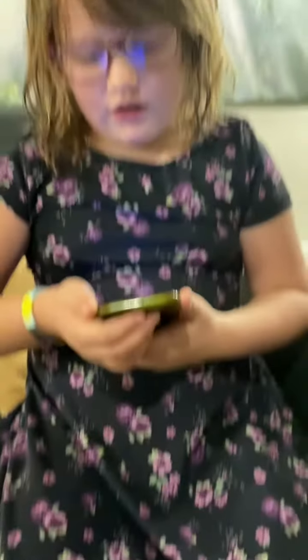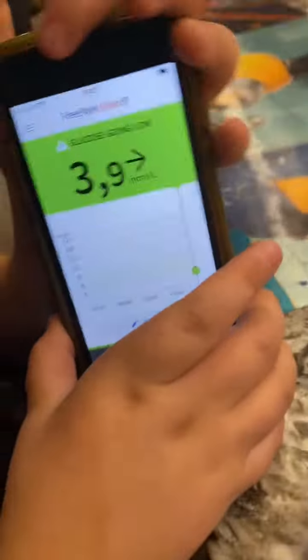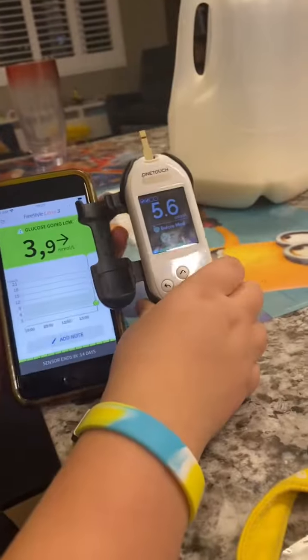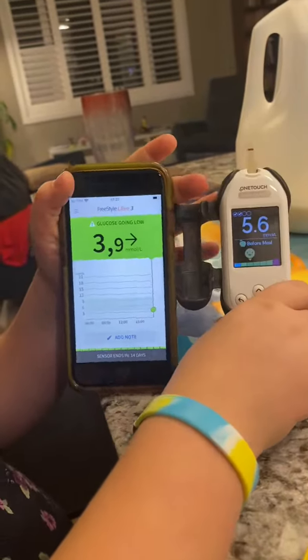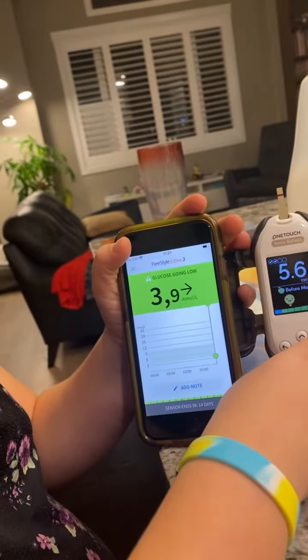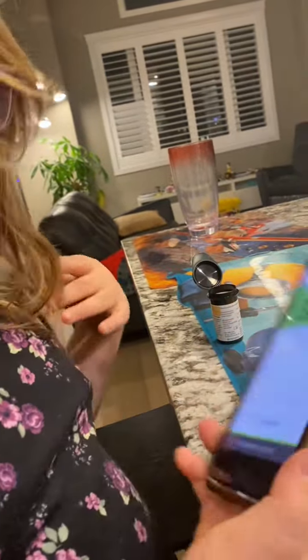Does mommy have it in her? Mommy will also have it. Okay, we are back — Libre 3. So it's recording. 3.9 — we just poked the finger. It was at 5.7; the sensor might be still adjusting. The Libre 3 will read a new reading every minute. Will it go up more? Yes, it might be adjusting.